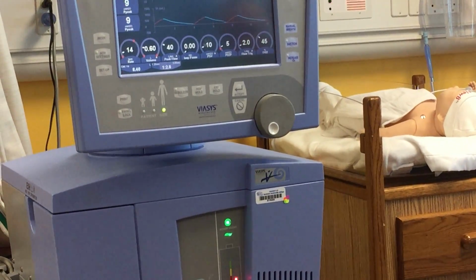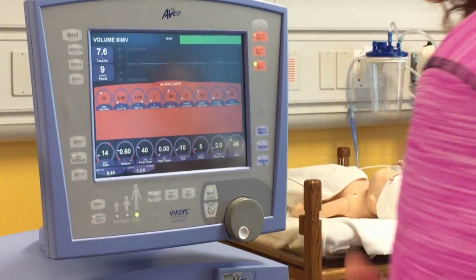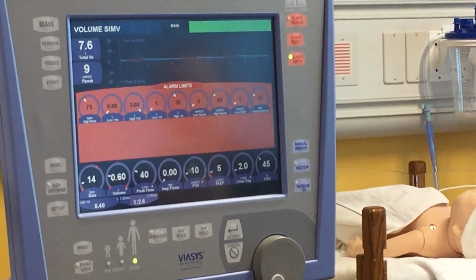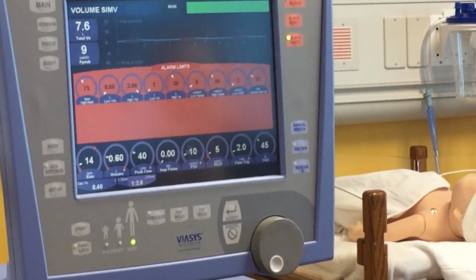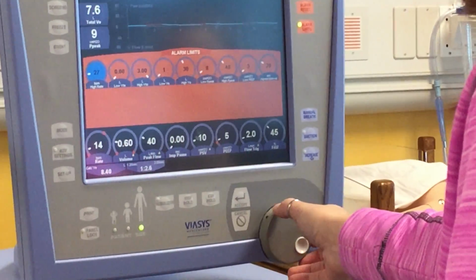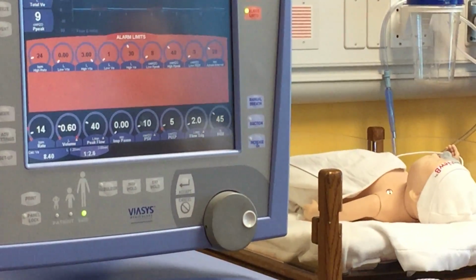Okay? So now let's go ahead and let's do our alarms. So hit alarm limits. Okay, first thing it is our high rate. Now your book tells you go 10 above what your patient's breathing. And I'll tell you, most hospitals set their high rate at 35. But we'll go by the book. So if our rate's 14, what's our high going to be? 24.